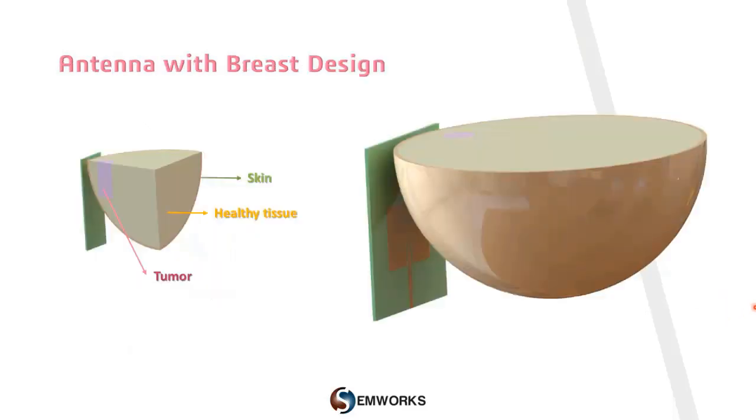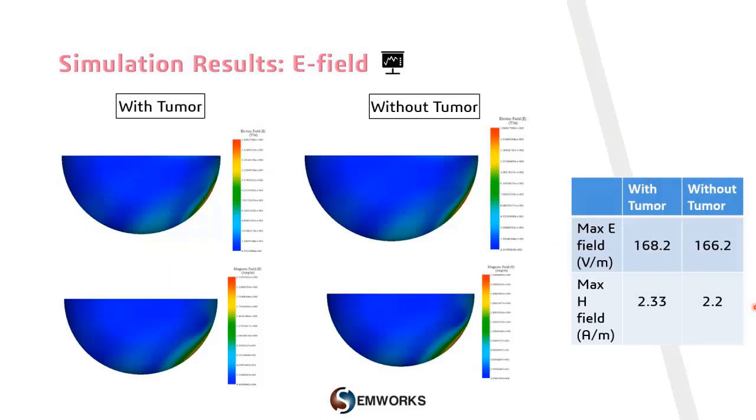In my simulation, the breast phantom model consists of skin and healthy tissues. The glandular part is ignored to reduce system complication. As shown in the following plots, when comparing electric and magnetic field intensities for breast with and without tumor, we note that in the presence of a tumor there is an increase in the maximum values. Differences between values of breast structures with and without tumor are clearly shown, considering thus alterations in electric and magnetic intensities. The incidence of a tumor in the breast structure can be detected.